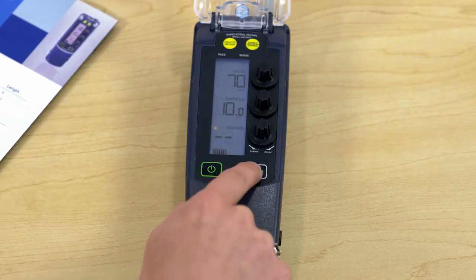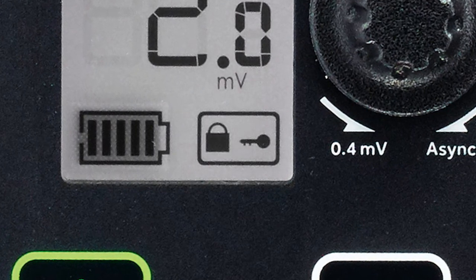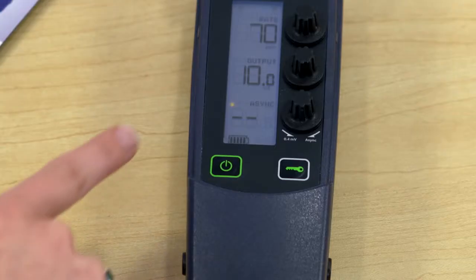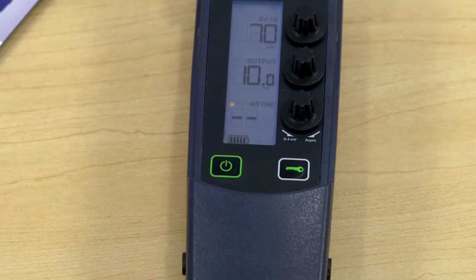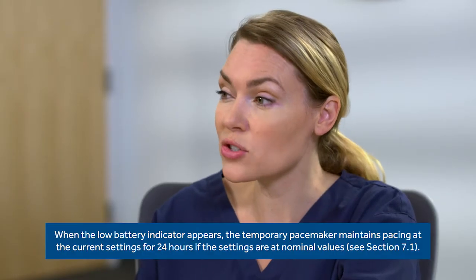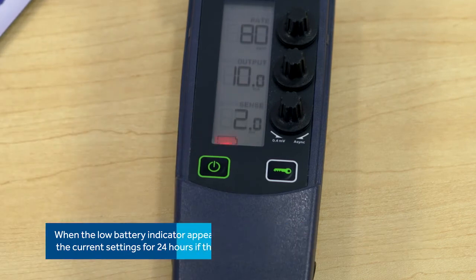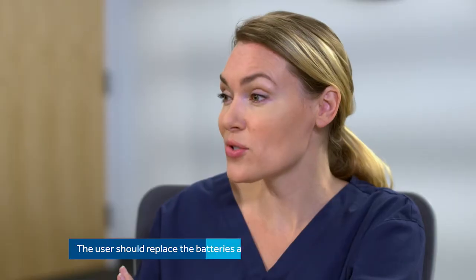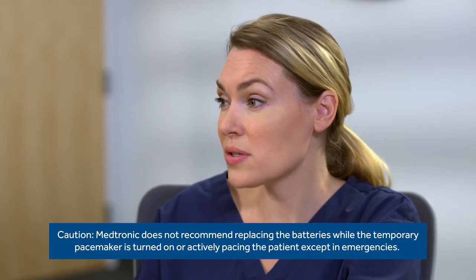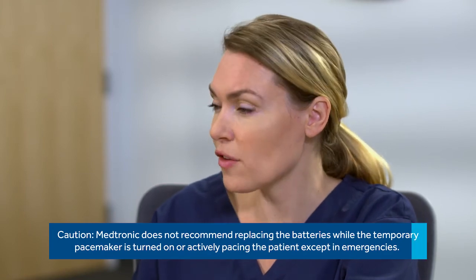Once the device is programmed, press the lock button — otherwise it automatically locks in 60 seconds, and then the lock indicator will appear. Now let's look at the battery indicator. When all bars are present, the battery is full. As the battery declines there'll be fewer bars, and when there's less than 24 hours left on the battery, the indicator will start flashing. When you see the battery indicator flashing, you should change the batteries. With each new use or patient, you should install a new set of batteries.